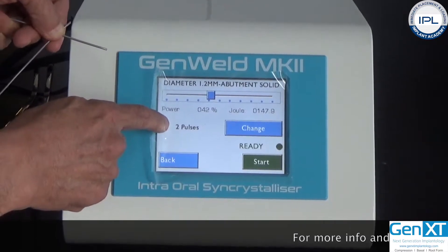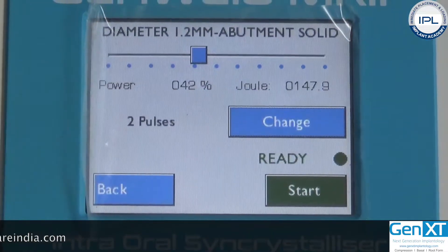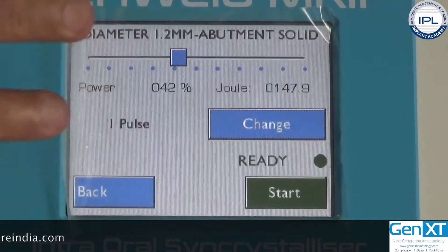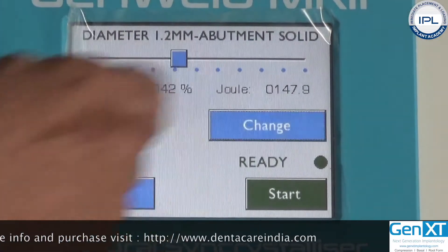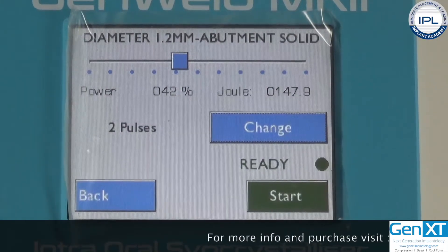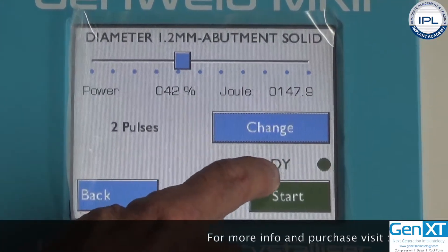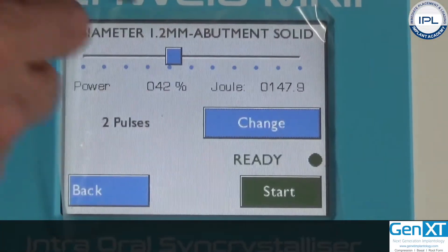Next, you can select pulse mode — one pulse or two pulses. I personally prefer two pulses. With one pulse, all the energy is delivered at once when you press the foot switch. With two pulses, the first pulse preheats immediately and automatically, and the second pulse raises the temperature of the titanium bar to its fusion melting point to complete the weld. When the machine displays 'ready,' it is all set to begin the welding process.